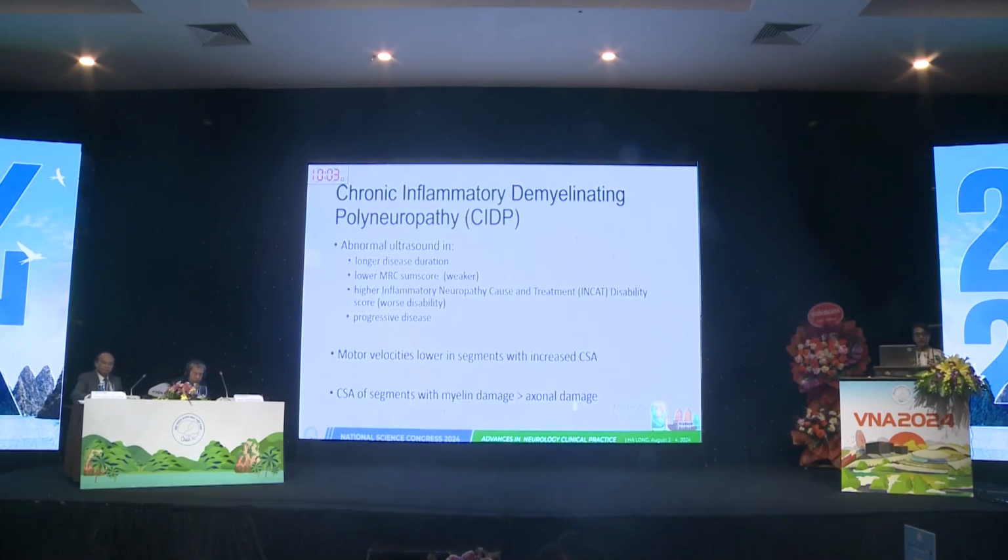If you look at the actual nerve on ultrasound, you will see that it's usually very large, much larger than you would see in GBS, for instance. The cross-sectional area tends to be much bigger the longer the person has had CIDP, because they go through this remyelination, demyelination, remyelination. That process is being picked up, and you can see it on ultrasound.